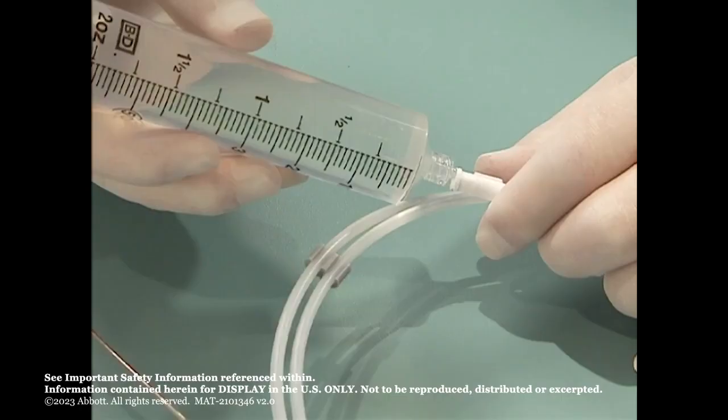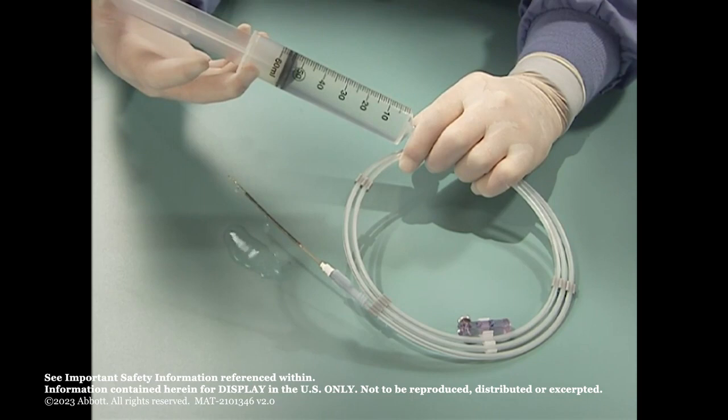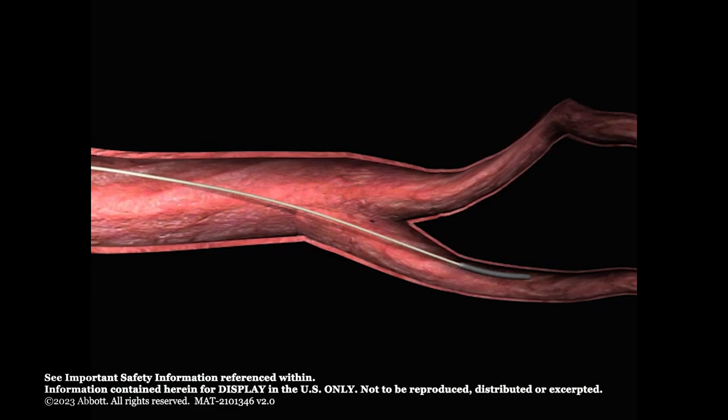Connect a syringe to the lure connector on the hoop dispenser and flush the hoop and loader with sterile saline until fluid flows from the loader distal tip to remove air from the loading device. Detach the loading device with the Amplatzer Vascular Plug 2 from the hoop and remove the delivery wire from the hoop dispenser.